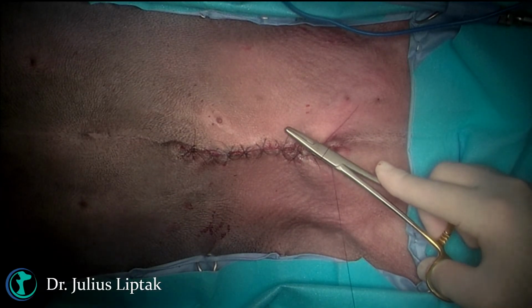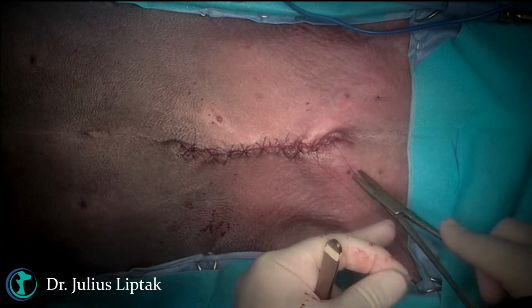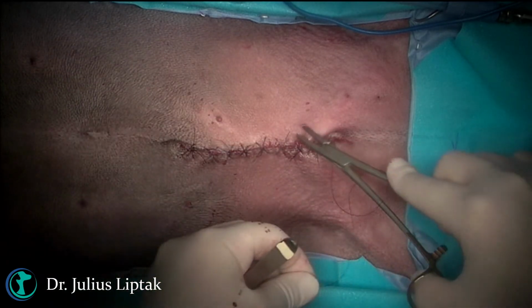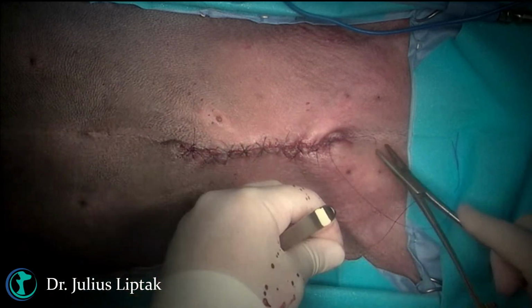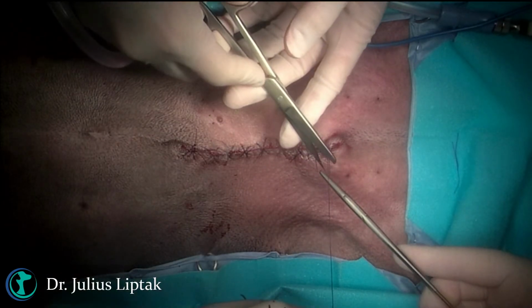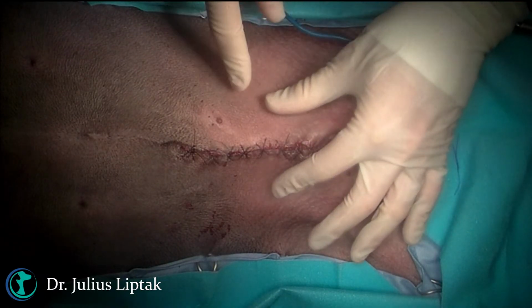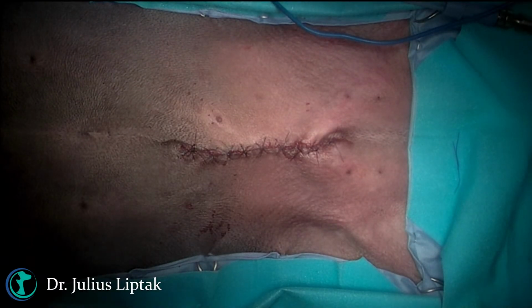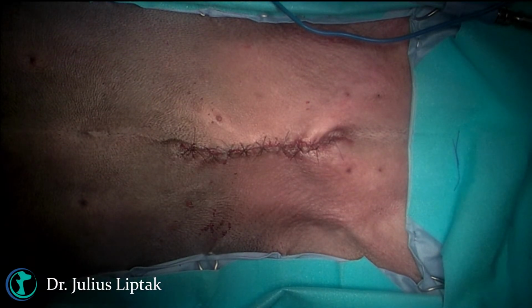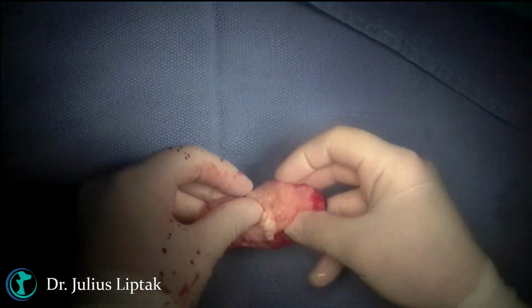So I'm just using PDS for the last suture rather than opening up a brand new thing. Okay, so multiple layers of closure just to reduce the tension. And maybe while that's there, I'm just going to show people how we ink this. I'm just going to grab the ink.